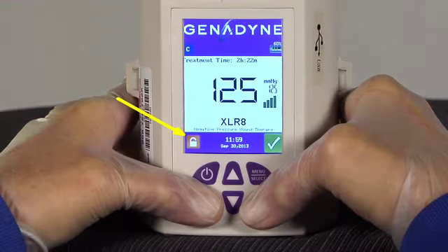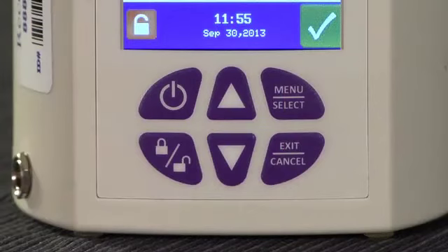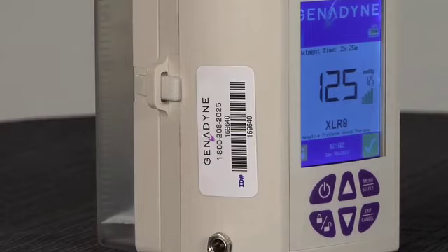To unlock the keypad, simply repeat the same process. The keypad will now be locked and the lock icon will change to the lock position. To unlock, repeat the same process and the lock icon will change back to the unlocked position. Finally, the exit-cancel button allows the user to exit the system menu and cancel current or selected functions.